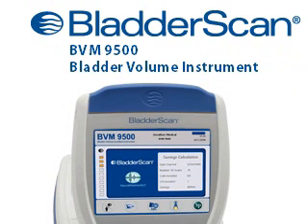The BladderScan BVM9500 gives you the bladder volume and bladder wall mass information you need quickly, accurately, non-invasively. The BladderScan BVM9500. Innovations in bladder ultrasound.